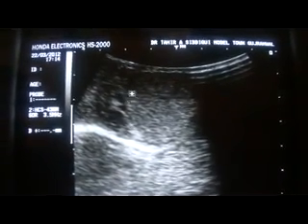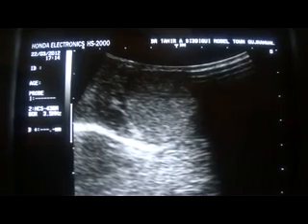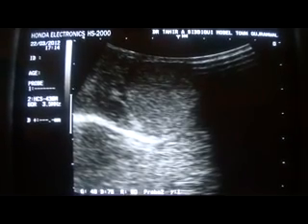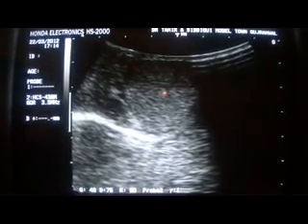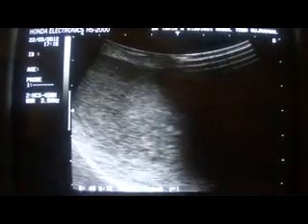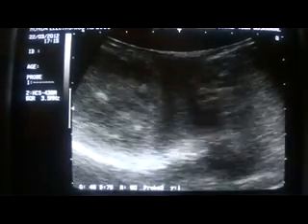However, in the right hemiscrotum, you are seeing the testis and this is the boundary of the testis. Here you can see bowel-like structures — bowel-shaped structures extending into the right hemiscrotum through the inguinal region.